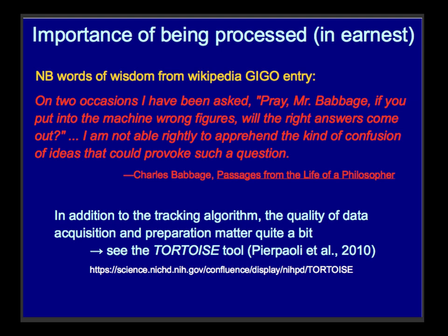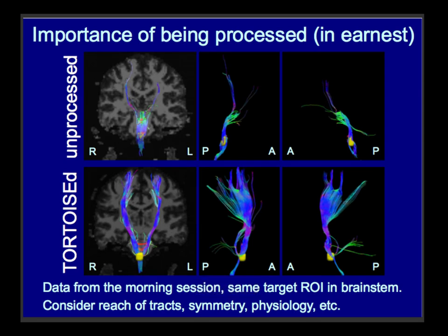From a DTI point of view, if anyone's ever doing this, this is a tool that we use. One of the esteemed authors of the tools is amongst us. Later on in the summer, I think Carlo Pierpaoli will talk, and Joelle Sarlls will talk about DTI, and they both know a lot about acquiring and processing data and things to watch out for. So that will also be educational.